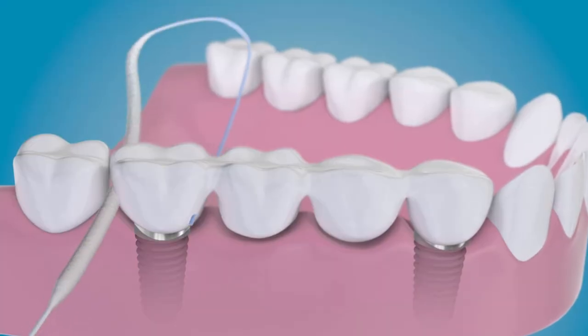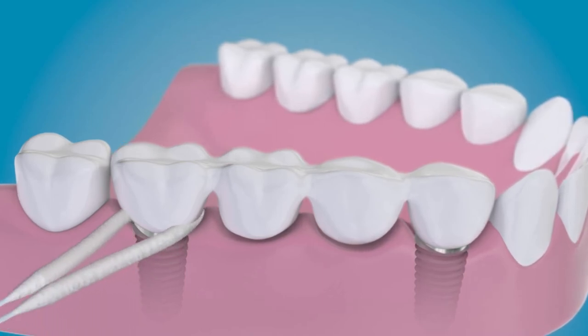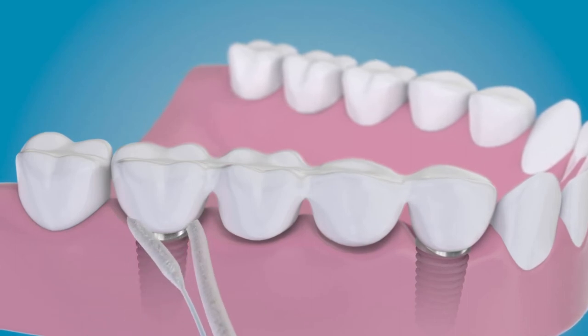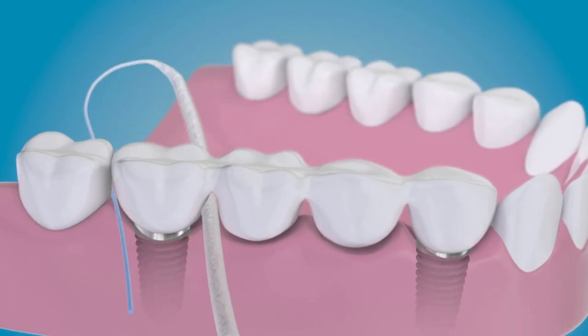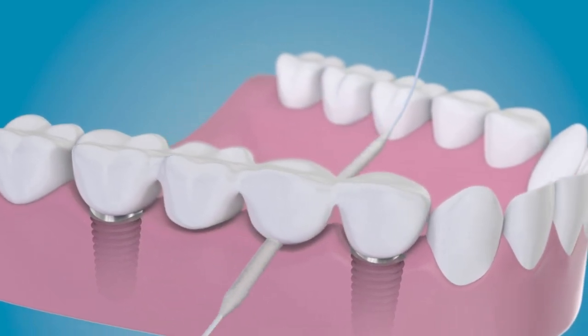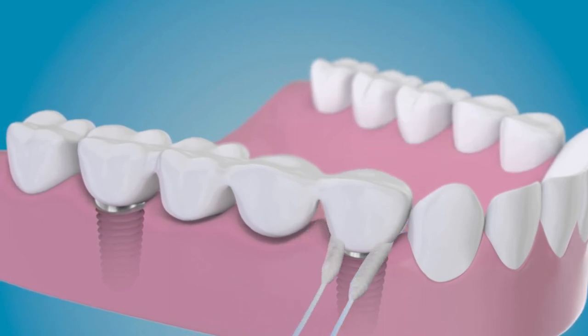It is also suitable for periodontal care. When using the Bridge and Implant Floss, you can soak the spongy middle portion in a medicament if desired. Insert one stiff end between the teeth or under your prosthesis — for example, a bridge or overdenture screw retained onto implants.